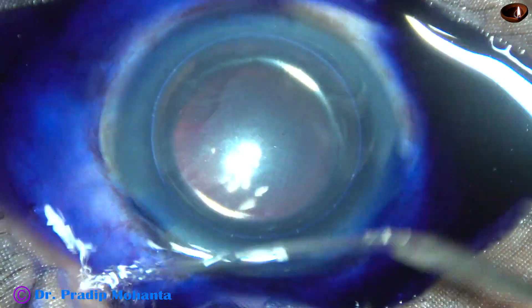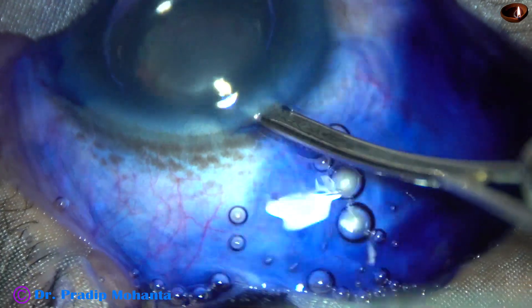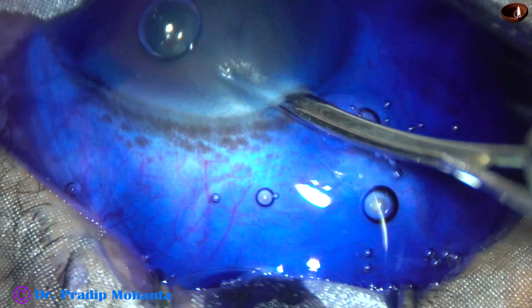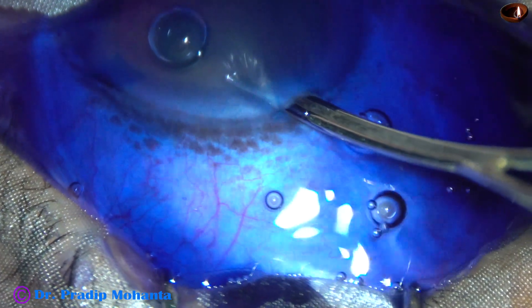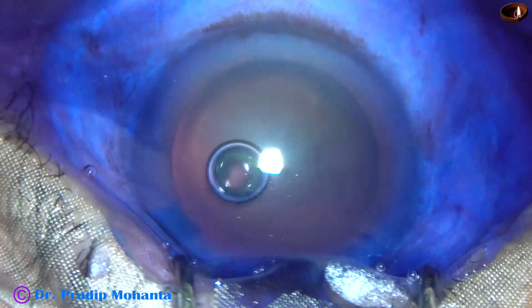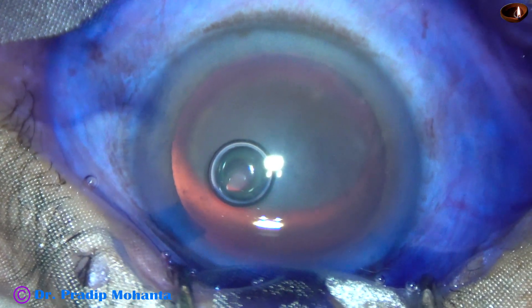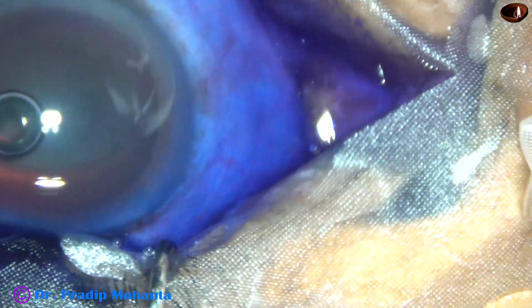There is a lot of fluid and trypan blue dye collecting on the ocular surface. This is because the eye is deep-seated. To avoid this, I am going to turn the head a little bit to the left side.